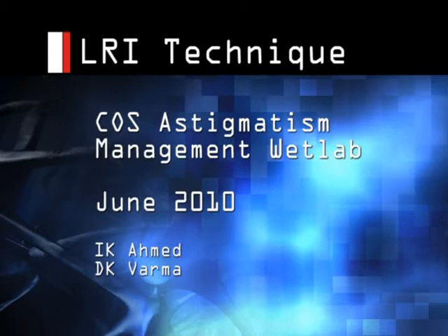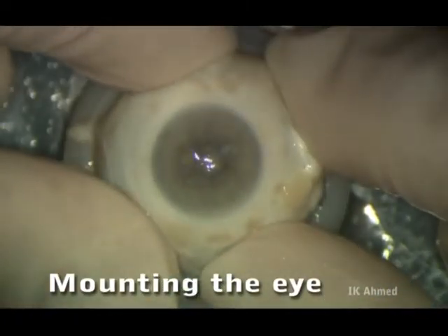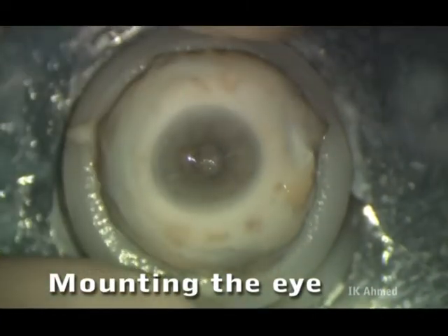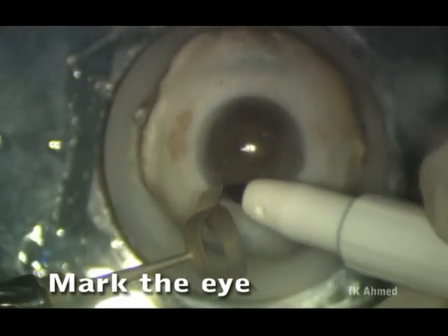This video demonstrates some of the skills that we'll be practicing during the COS astigmatism management wet lab. Here we are mounting the eye in the suction device, positioning it, and then a syringe is withdrawn to induce suction and secure the eye.